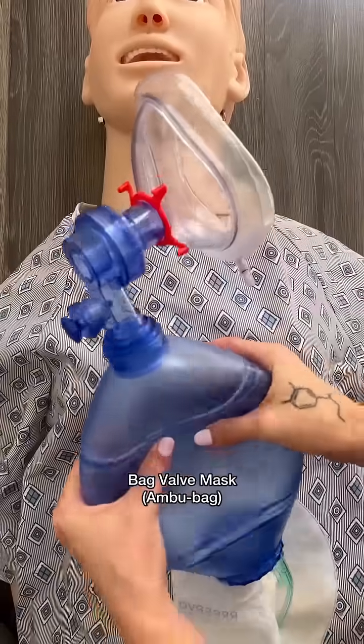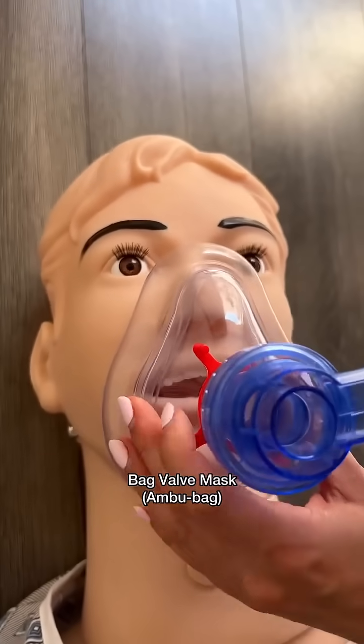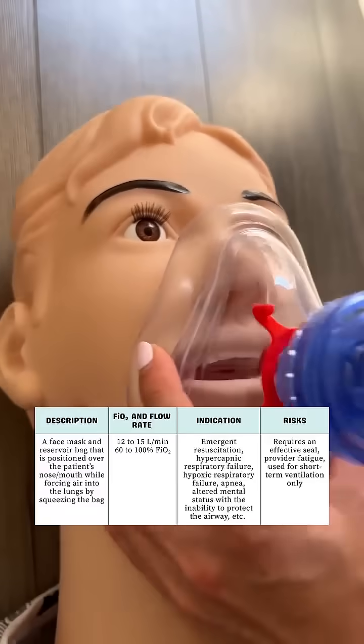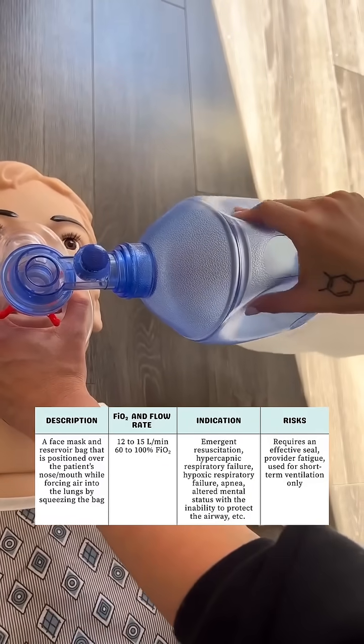And then last case scenario, we have an ambu bag, for emergency resuscitation, respiratory failure, altered mental status with the inability to protect the airway, and we're preparing for intubation. We make sure this is positioned tightly over the mouth and the nose.